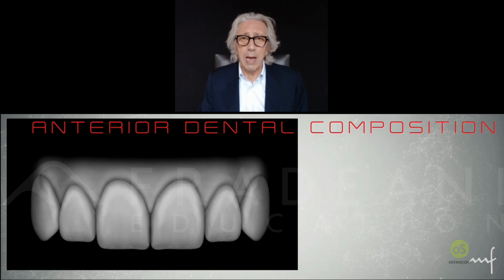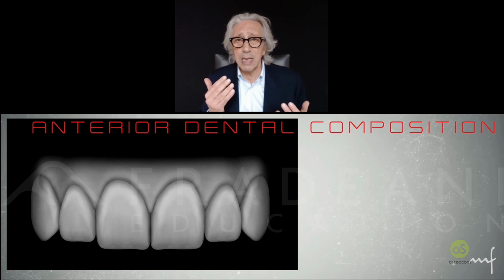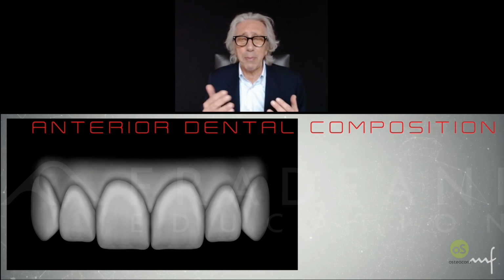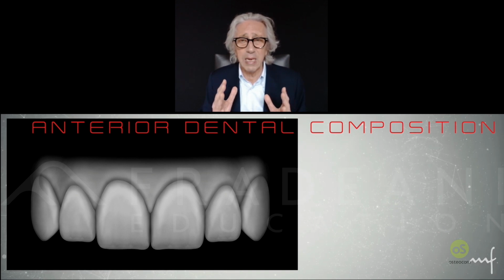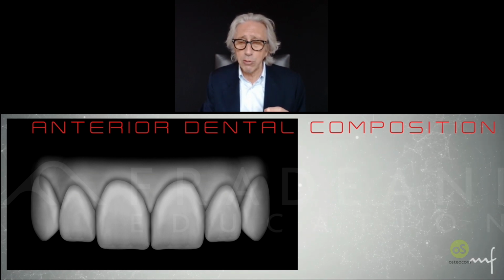Again, I don't like to be perfect right and left. I would prefer to have lateral incisors that are not perfectly aligned, more in, more out. But the patient doesn't want this kind of result. So our goal is to have patients who are happy without any compromise that is not acceptable. Of course, it should be an acceptable compromise, just in case you believe that it is a compromise. So actually, I would like to start.